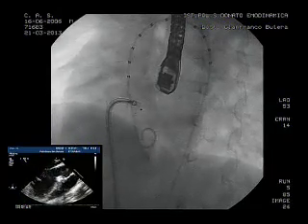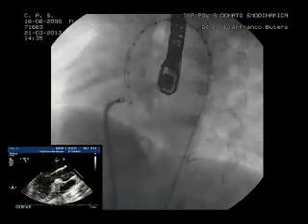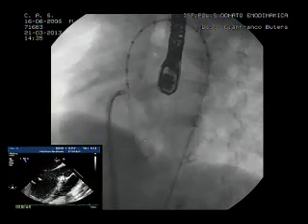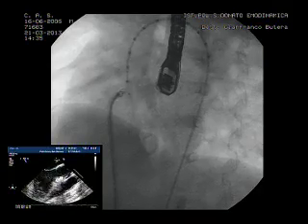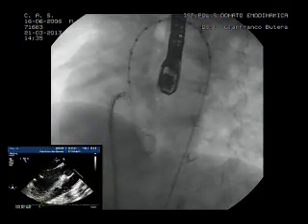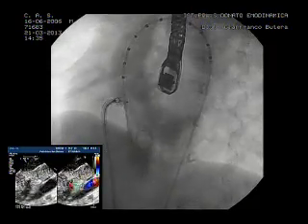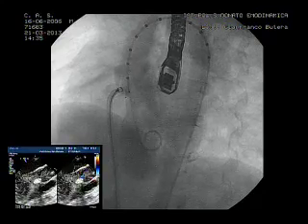Well, I need to see live, guys. Sorry? Who's doing it? Yeah. No, it was not live. Yeah. So now we came back, and we are at the septum angio. Is your pigtail entrapped between your device? No. I'm not worried about that yet.